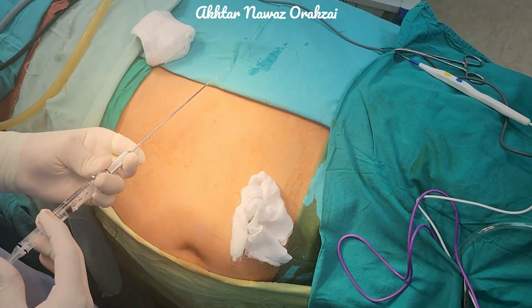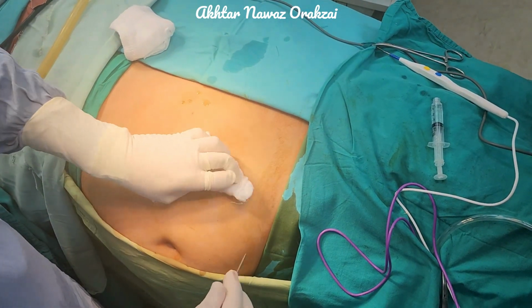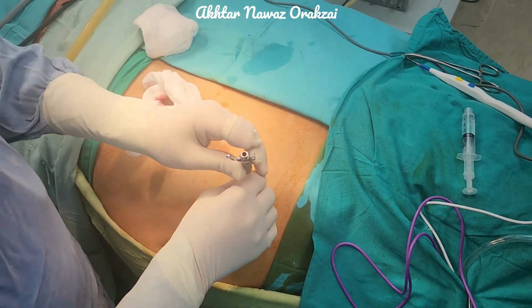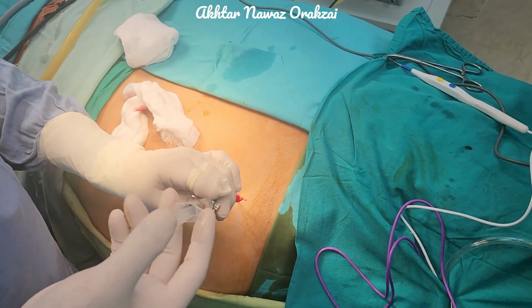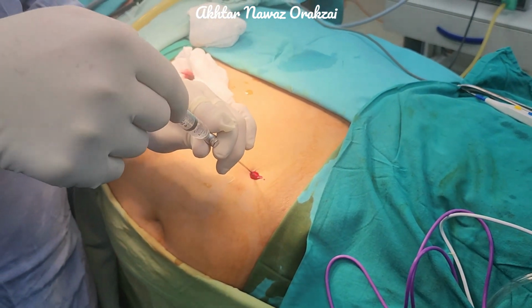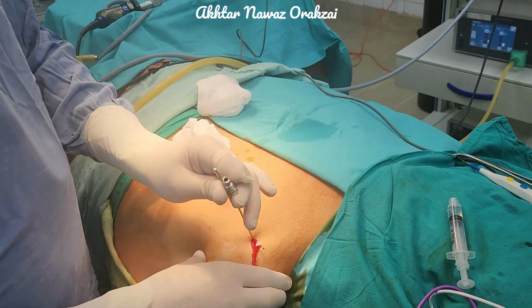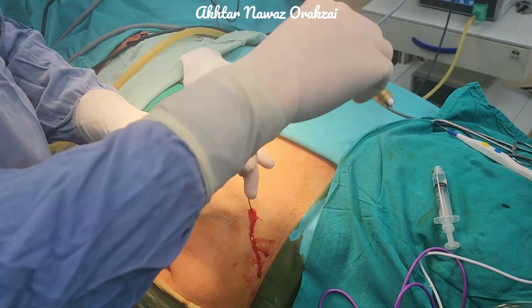So we check the patency of the needle. One click, 2 clicks and 3rd click, and now we will see whether this is in the peritoneum. We put in saline and then aspirate it. It is not coming, so most probably we are in the cavity. And then we do the hanging drop test, which is going smoothly into the peritoneal cavity. And then we attach the gas.